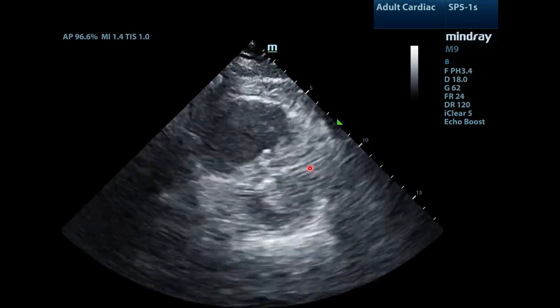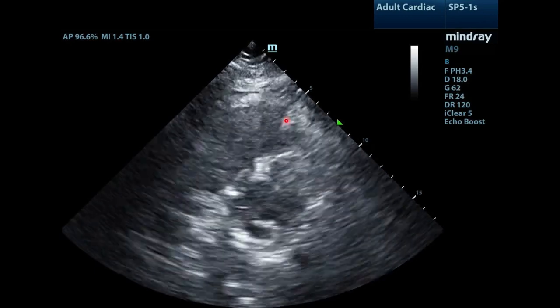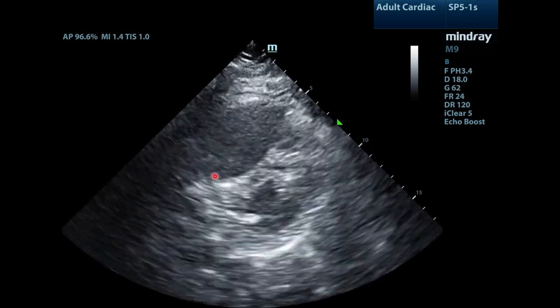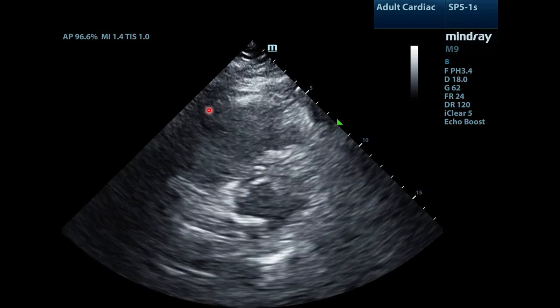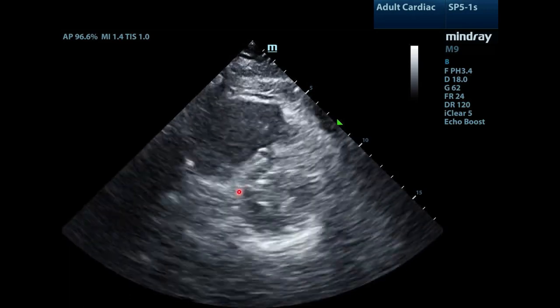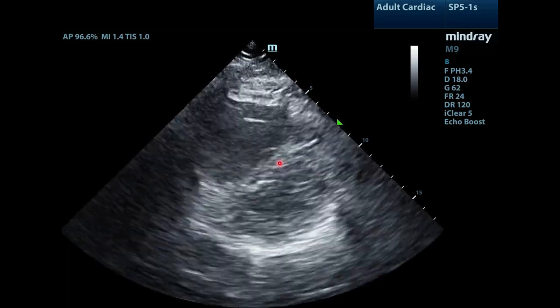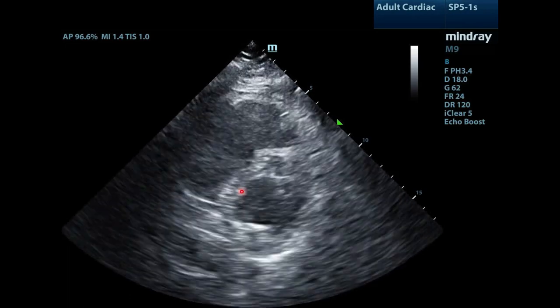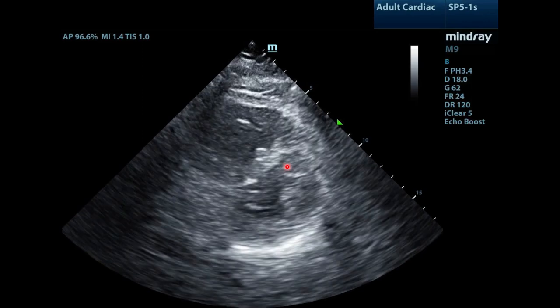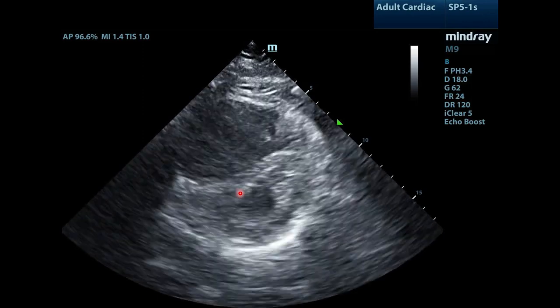We move to the short axis view. You'll notice that there's still a large right ventricle, a flattened interventricular septum, and the D sign of the left ventricle.